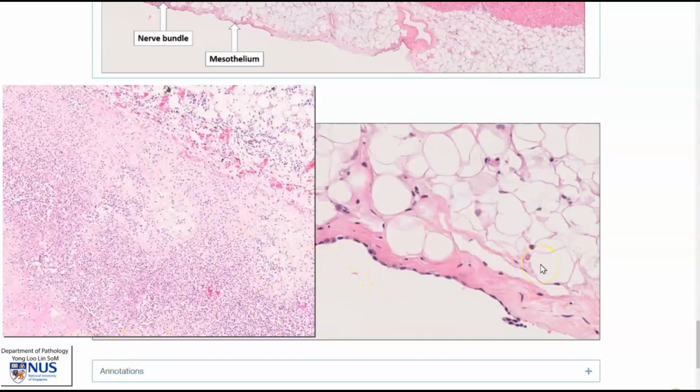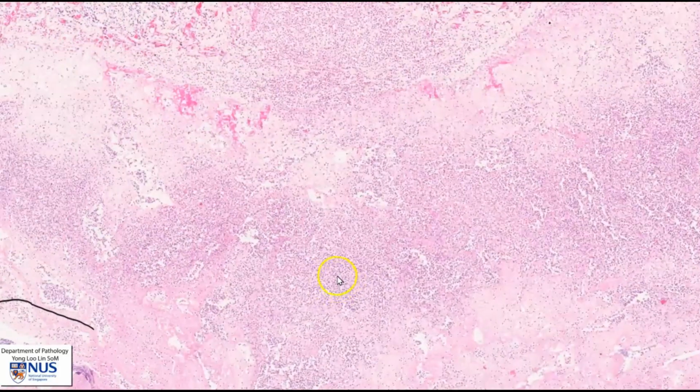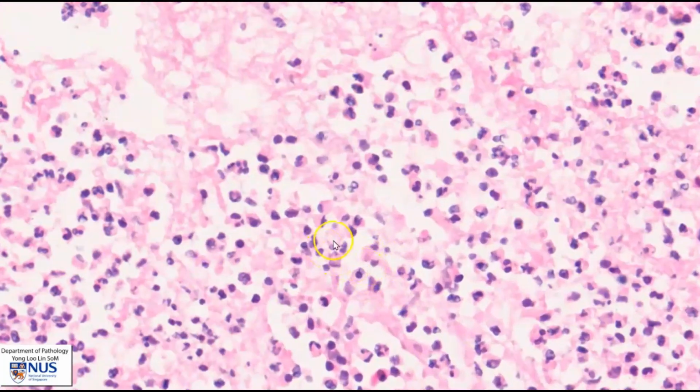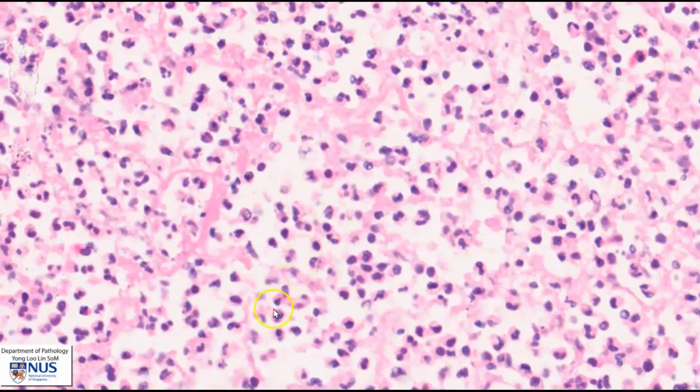Let's return to the virtual microscopy slide. And here in this virtual microscopy slide, we are focusing on this area, which shows the acute inflammatory purulent exudate within the pericardial sac. So this inflammatory exudate is composed predominantly of neutrophils. We can see the multi-lobed nuclei of the neutrophils. Many of these are still viable or alive, and some of them show degenerative changes.